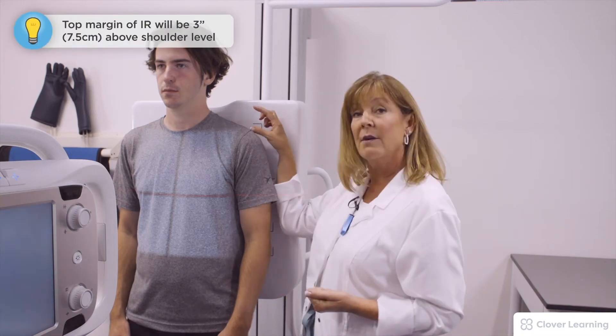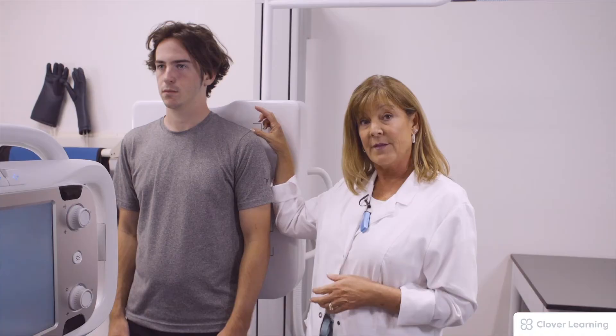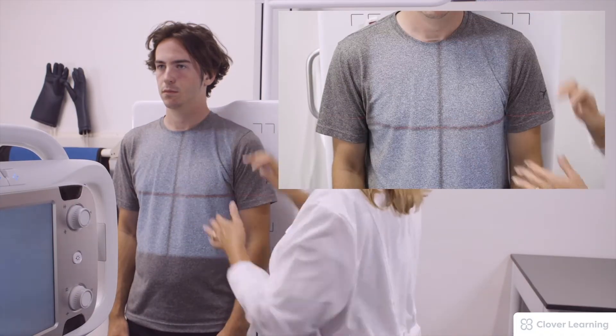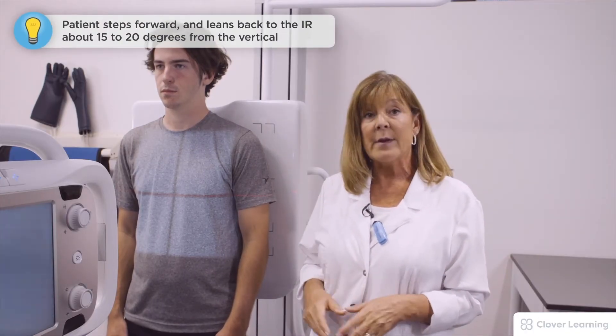Our patient is AP standing at the upright bucky. I'm still using 72 inches. The top margin of the IR will be about three inches above the level of his shoulder. The central ray will be in the mid sternum. We're going to use the lordotic position, which requires him to push his shoulders back against the board and step his feet out one to two feet.